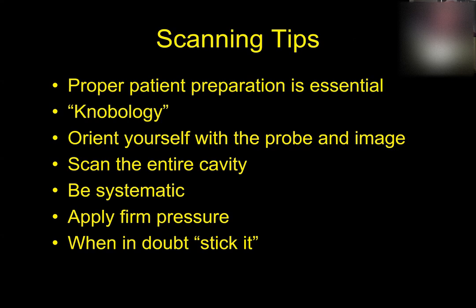Okay. So it's not like x-rays where you can press the button, you get a picture. Ultrasound is moving your hand around and having the probe in the right orientation, and you're going to be constantly adjusting the gain, the depth of the image, and things like that. So it's kind of a very interactive imaging modality. The other thing that I would tell you when you're getting ready to scan the abdomen is you always want to scan the entire cavity, and you want to be systematic in the way you scan it.